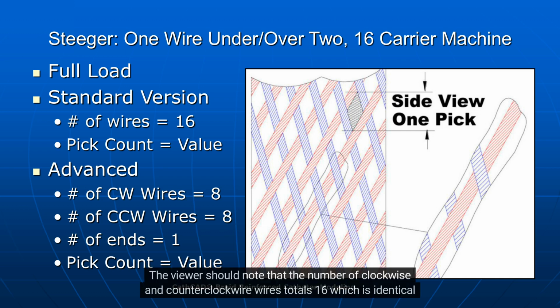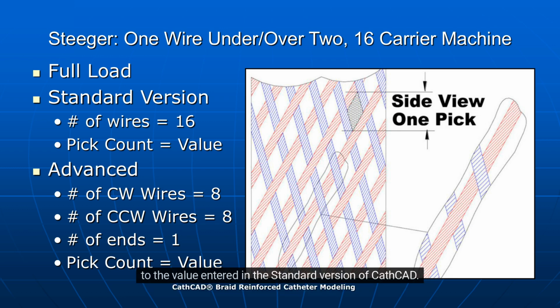The viewer should note that the number of clockwise and counterclockwise wires totals 16, which is identical to the value entered in the standard version of CathCAD. The number of ends is set to 1. The pick count entered should be that of the desired value.